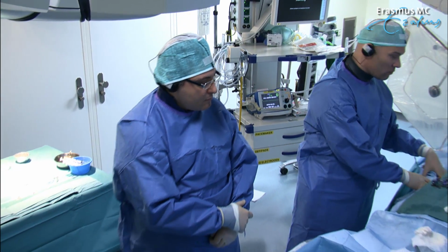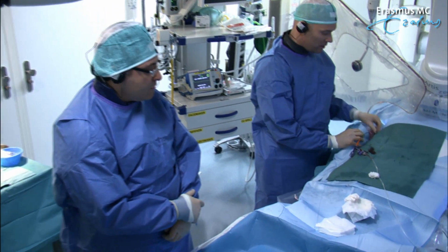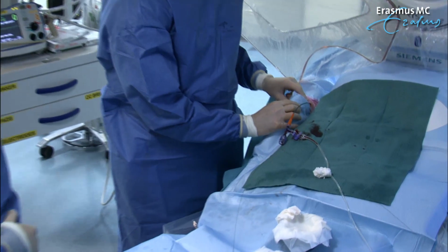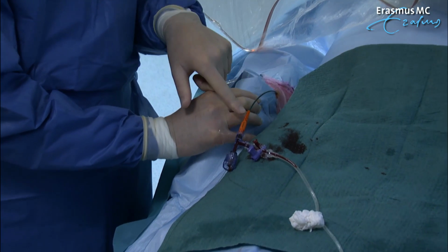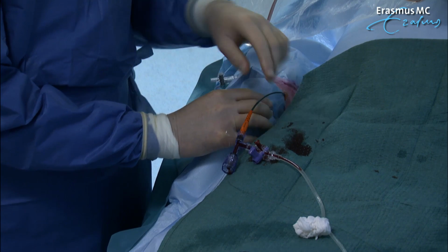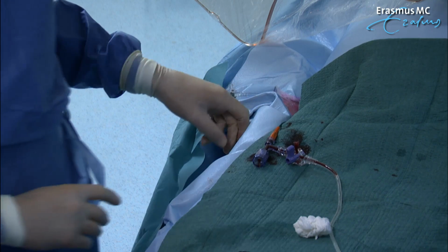We have a right radial access, where we have a 7 French sheath in place. So this is a 7 French slender sheath. The slender sheath technology allows us to have less radial spasm. So we have a 7 French left Judkins 3.5 shape. And then we made our angios for today.